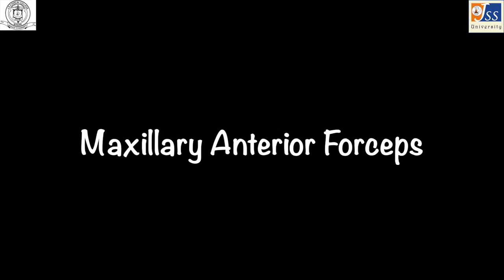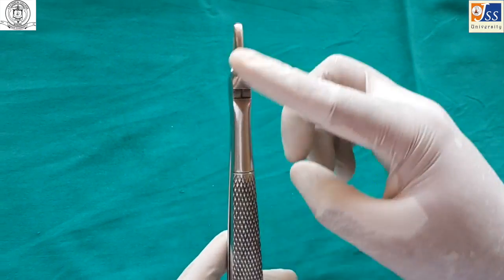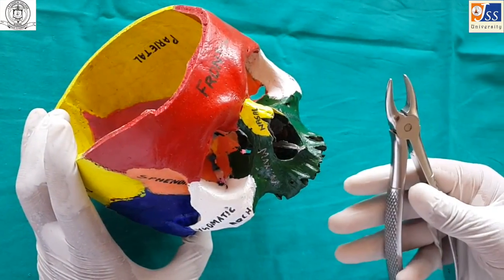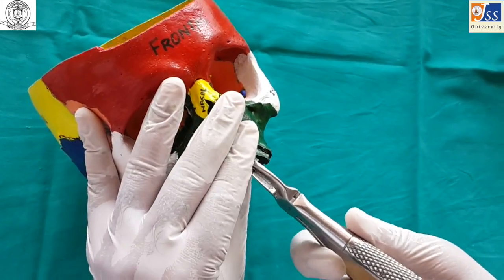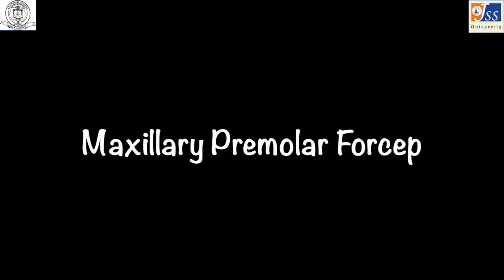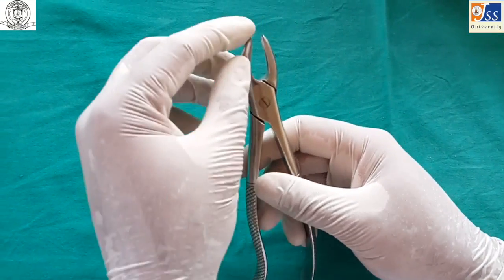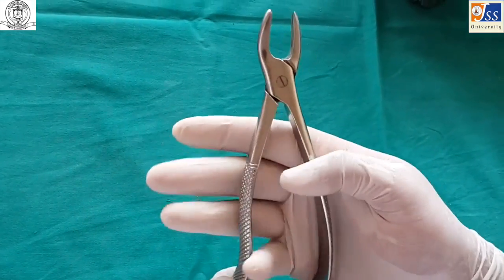Maxillary anterior forceps is used for the extraction of maxillary anterior teeth; this forceps is completely straight. Maxillary premolar forceps is used for the extraction of maxillary premolars; it is slightly curved and is held so that the concave part of the handle rests on the palm.